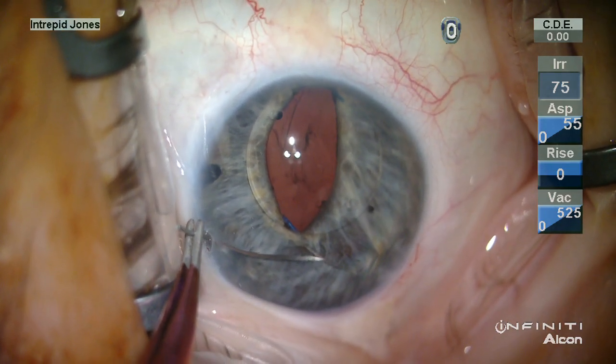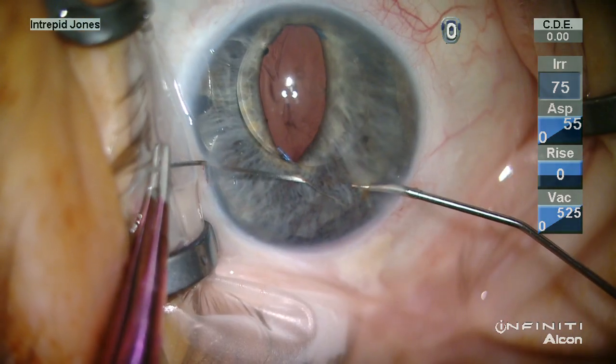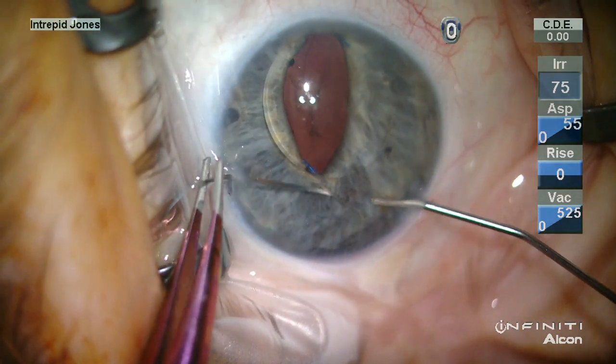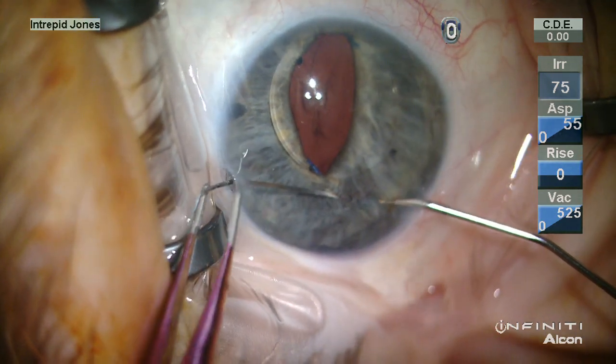Because the entire lens is not visualized, by elevating the lens against the iris, it is apparent the lens is indeed intact with no obvious defect.